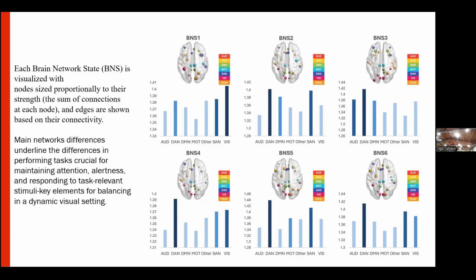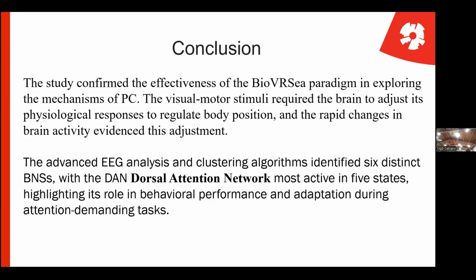To make the story concrete and give you a hint of what we have found out, we are basically showing that there are quantitative indexes that can distinguish early stage Parkinson's from healthy individuals pretty well by using this methodology. Of course, this methodology and the postural control task is nothing that you can imagine in a clinical setup tomorrow. So what we are working on is to resize those paradigms into something that can be used in a clinical setup.